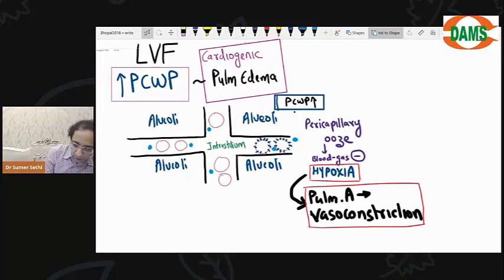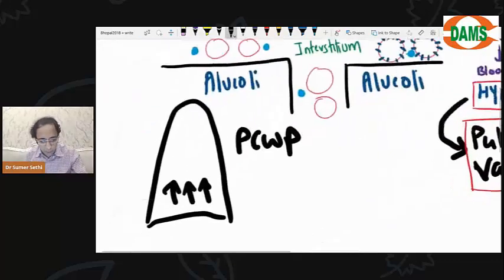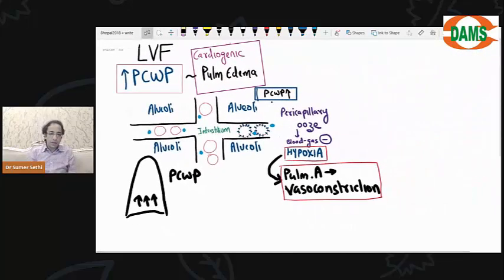Now listen to me. The problem in the lungs is, PCWP is highest in the lung base. Okay. In a normal person also, capillary pressure is highest in the lung base.